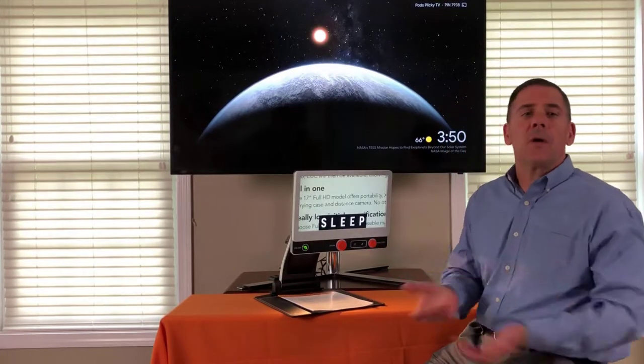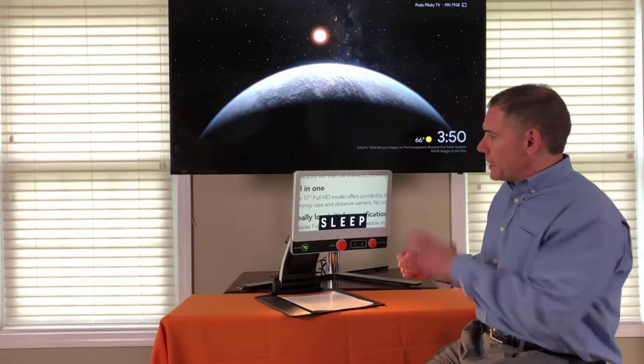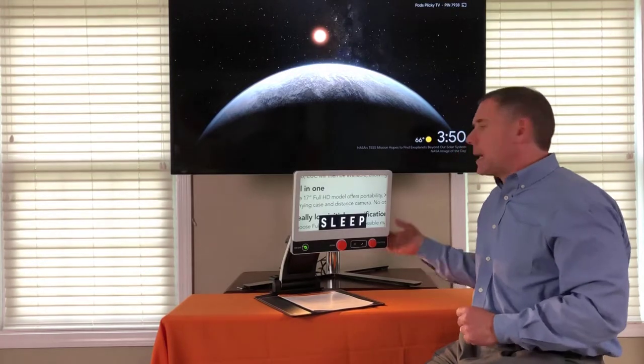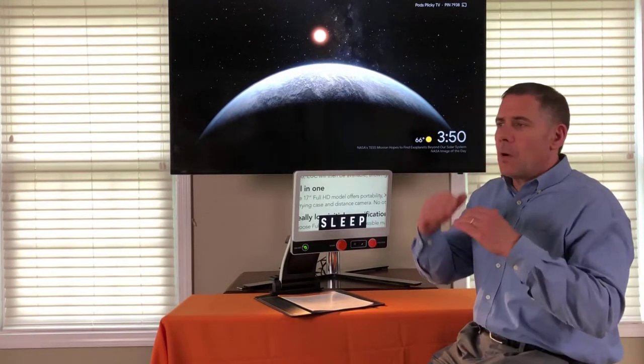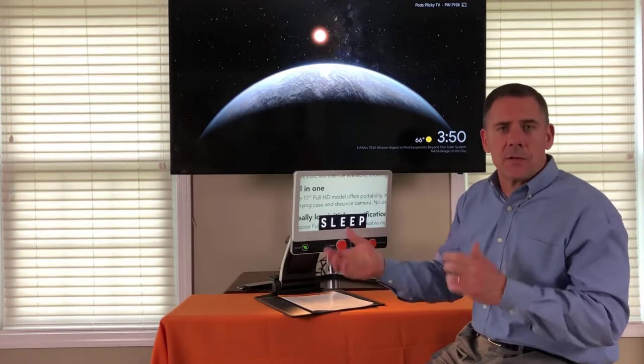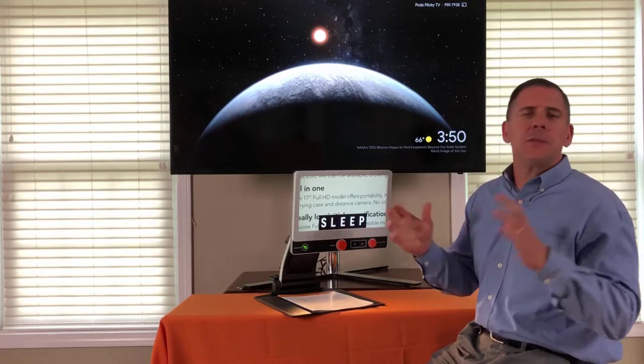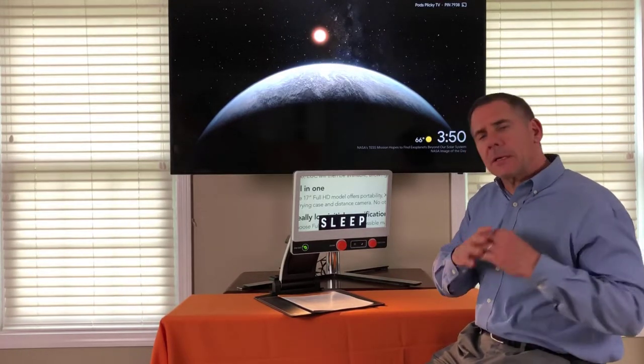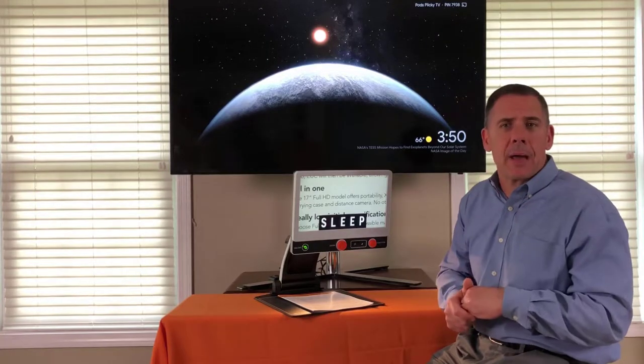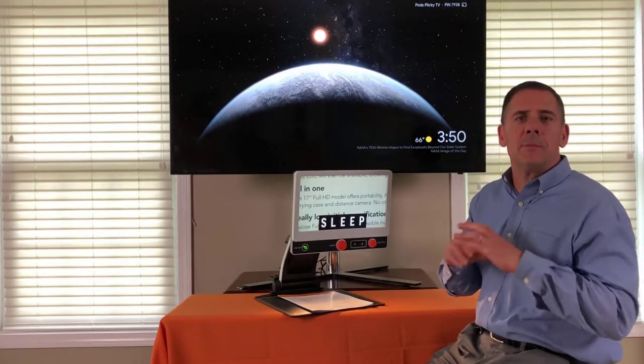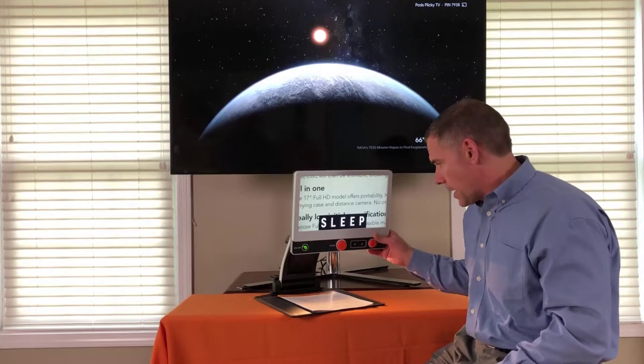After the lamp, I have sleep. You saw my screen and my light go to sleep after whatever incremental time you set it to. It has some settings in there. This is fantastic for extending the life of the battery. It's a five to nine hour battery in it. Using sleep mode helps amazingly.